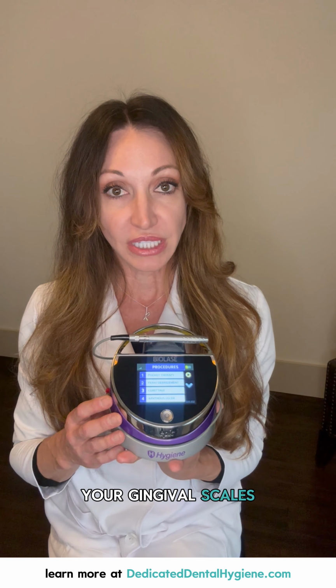So the type of appointment you would be seeing a patient for is generally going to be your prophylaxis, a perio maintenance, or even with your gingival scales. You will be selecting pocket therapy. Now the preset on my pocket therapy is going to be 0.5, and over here on the right hand side of my screen you can see where it says CP followed by a 10.